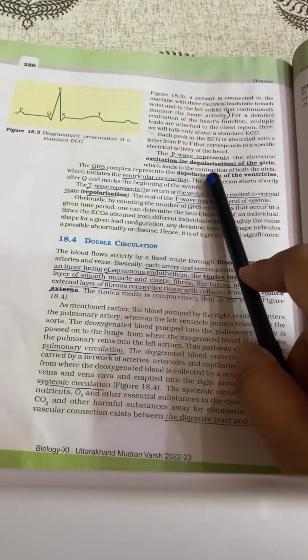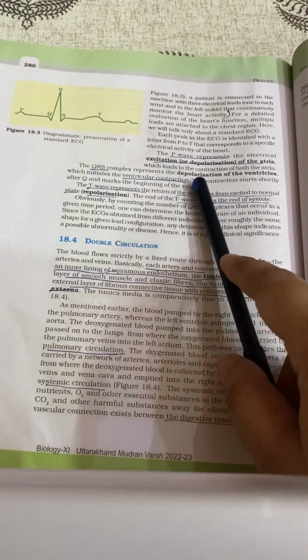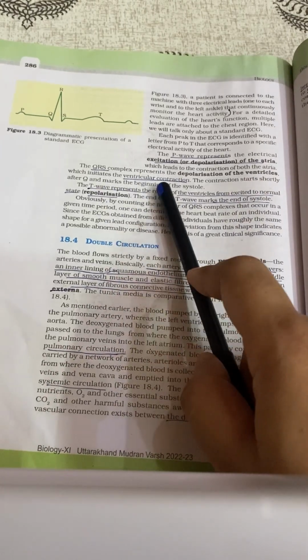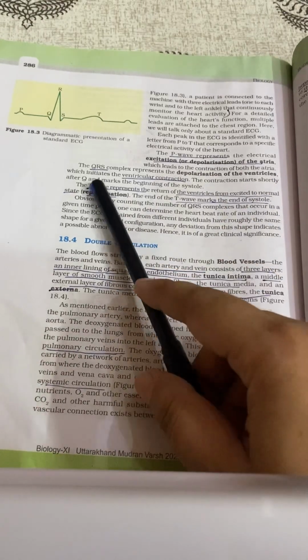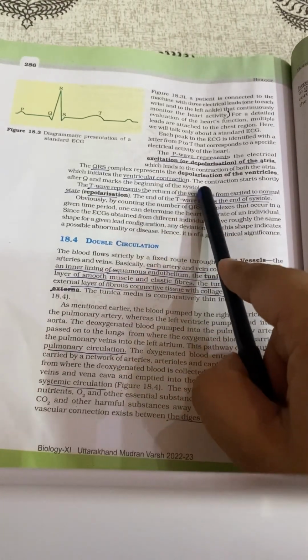So you can also see here the P wave represents the electrical excitation or depolarization of the atria, which leads to contraction of both the atria. The QRS complex represents the depolarization of the ventricles, which initiates ventricular contraction. The contraction starts shortly after Q and marks the beginning of the systole.